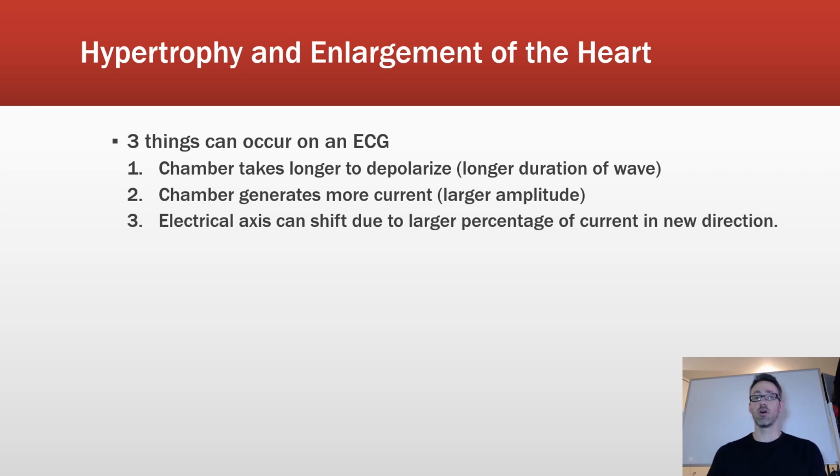If we took the average of all of that over that time period, we'd have what we call our mean vector. That mean vector, or the average vector, generally points towards the left, because the left ventricle has more muscle mass. When it points towards the left, it points towards leads 2 and 1, so that's right around 0 degrees and 60 degrees.